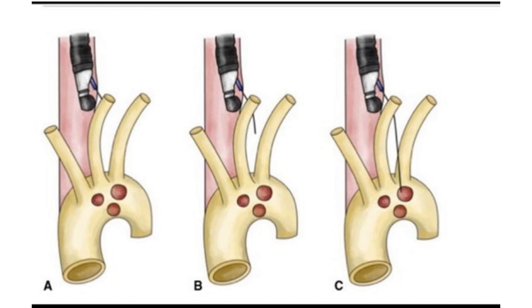So this is the window you use from the proximal esophagus. A window is found medial to the subclavian origin. Then, using the wheels of the echo endoscope and the elevator, you pierce those lymph nodes to get to station 6. Contrary to the belief that station 6 can only be accessed with a transvascular technique, it's not true. It can be accessed without traversing the aorta as well.